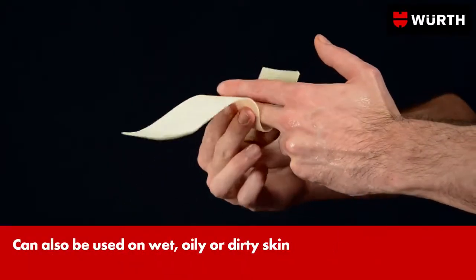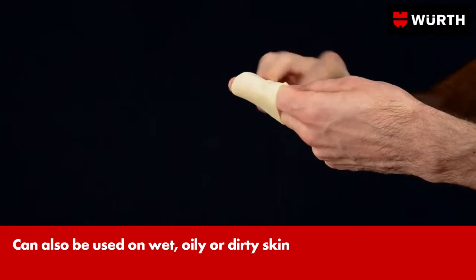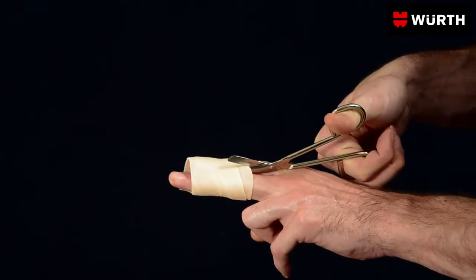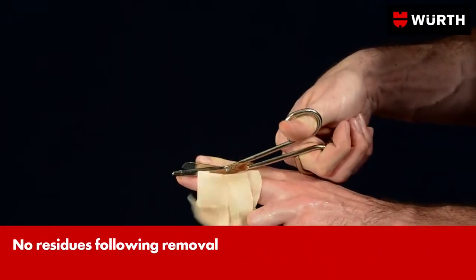The plaster adheres only to itself, not to the skin or the wound. In this way, it can be removed again completely painlessly without opening up the wound again.